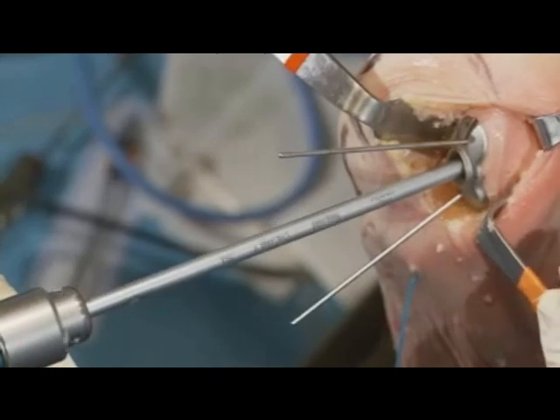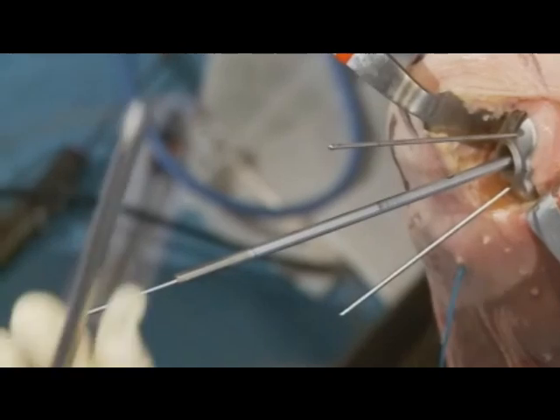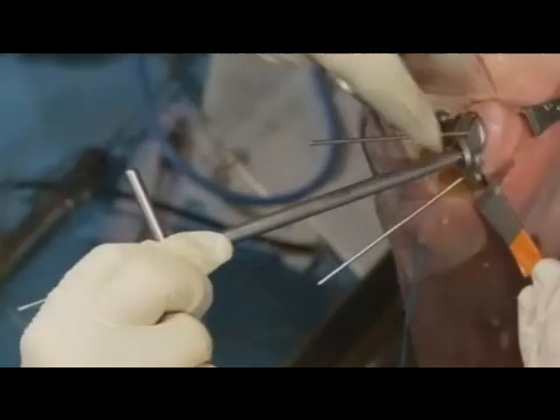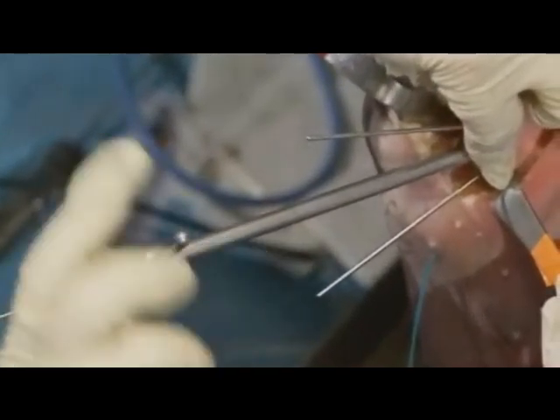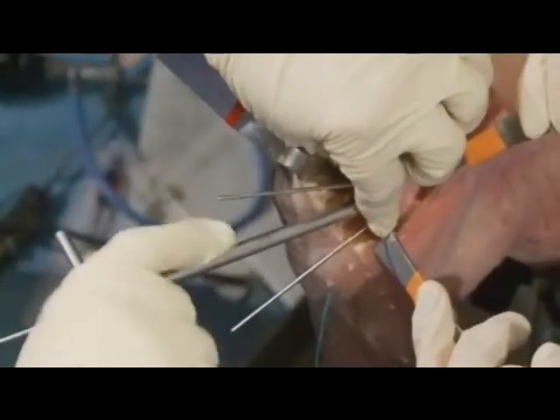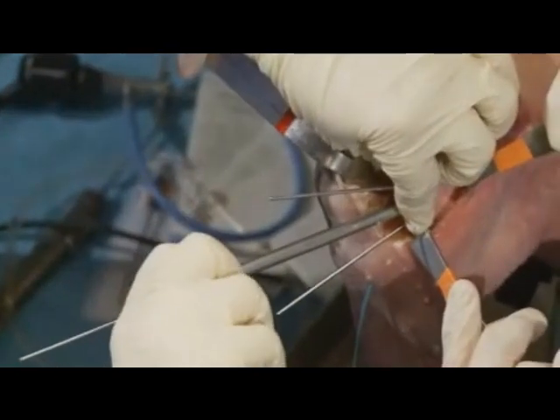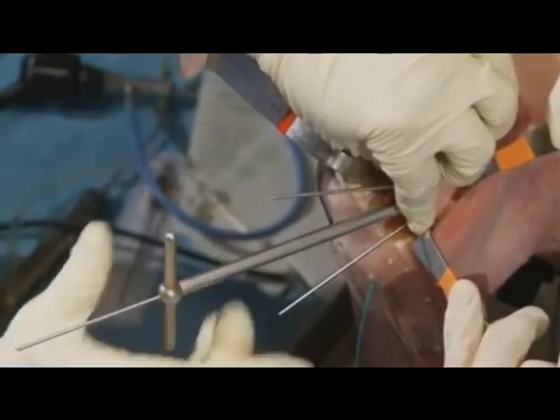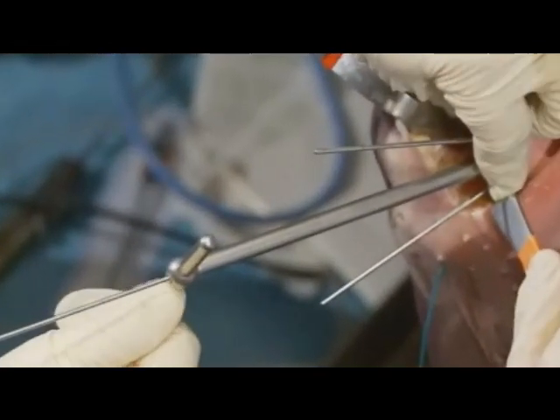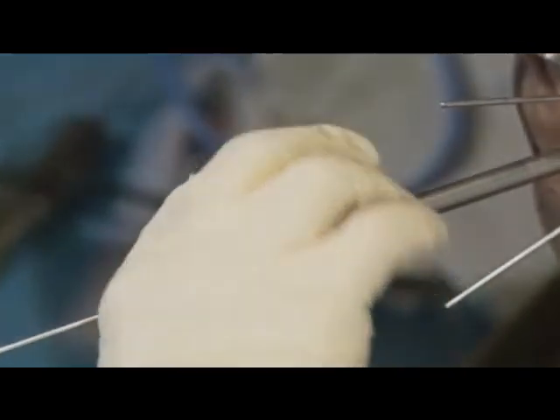So we're down now, and then again, over the drill, we use a tap, and this cuts the threads for our screw device. So we're going to tap this, and once we see the end of the drill come to the end of the tap, and it's just coming up now. I don't know if you can see here. Can you guys see it? The tap and the drill are symmetrical here. They're flush. I think you can see it just barely there. And now you know that you've tapped deep enough for the screw.